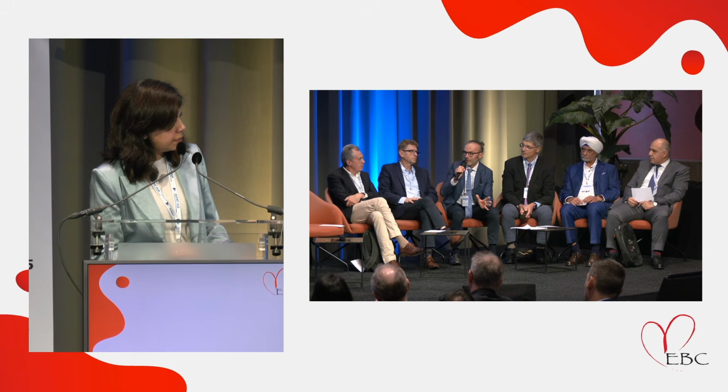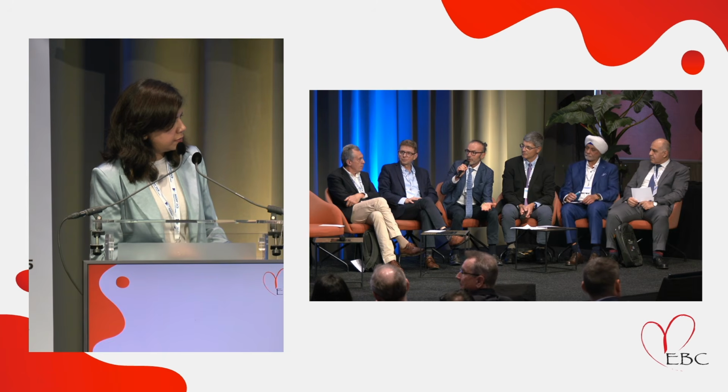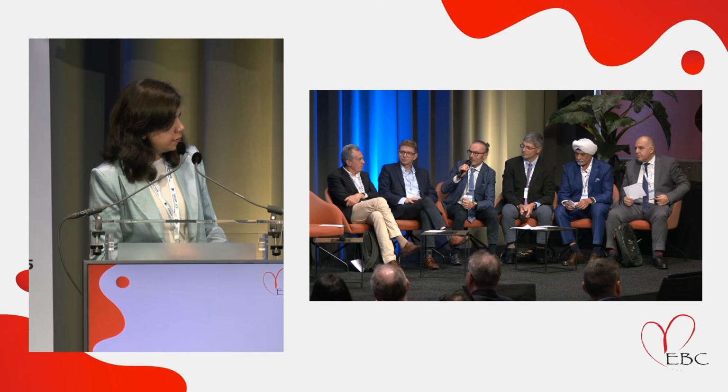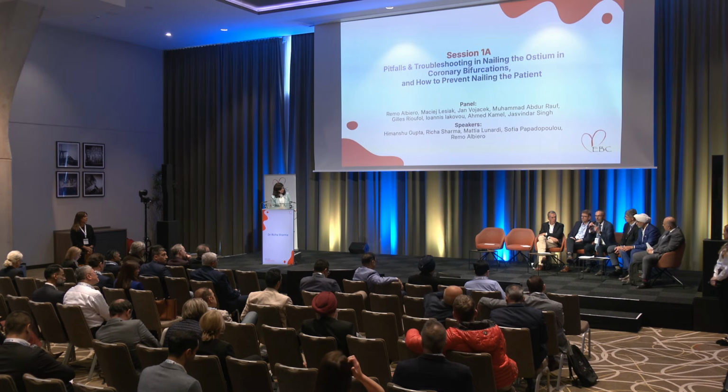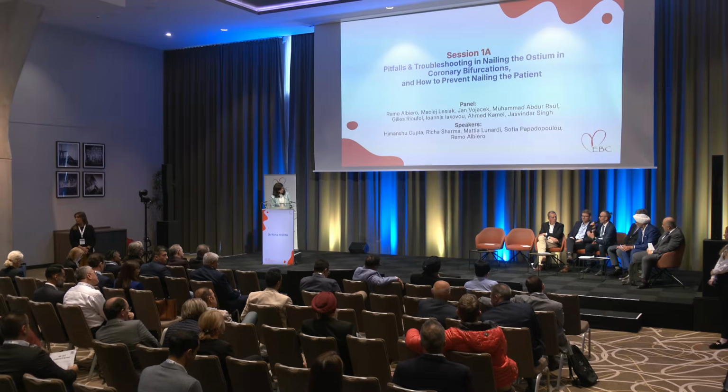You should crush the LAD and then go with another stent. If you crush, you can have a problem because sometimes you cannot go below the strut protruding in the circ. So there is a tip that you can do. If you are unable to go below the strut of the stent from the LAD protruding into the left main, you are unable to go outside the stent, you have to occlude the LAD stent with the balloon.